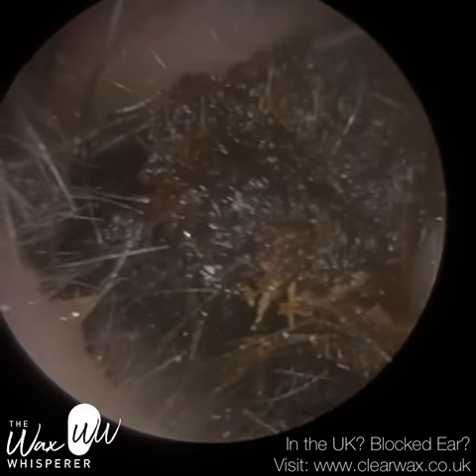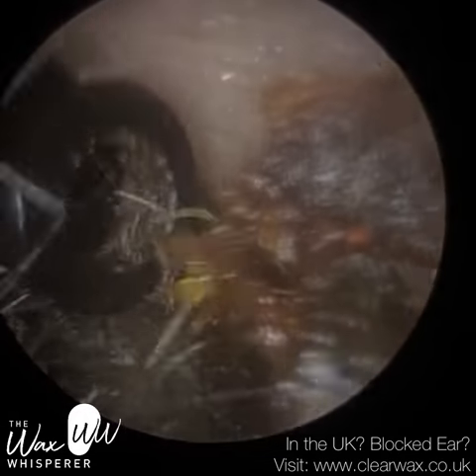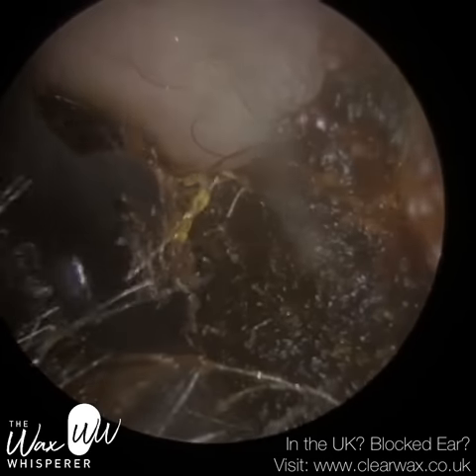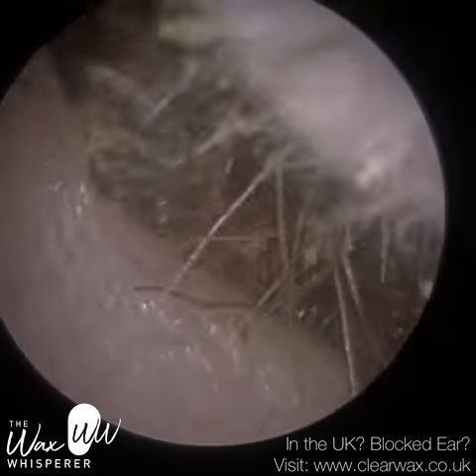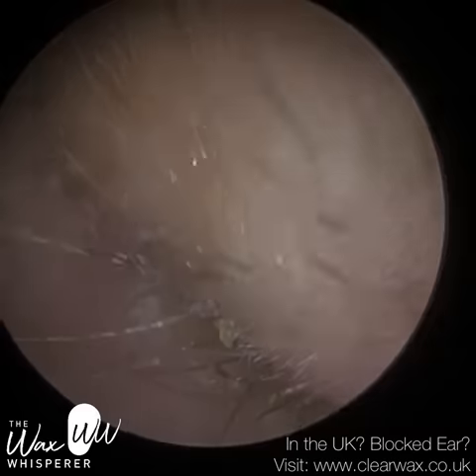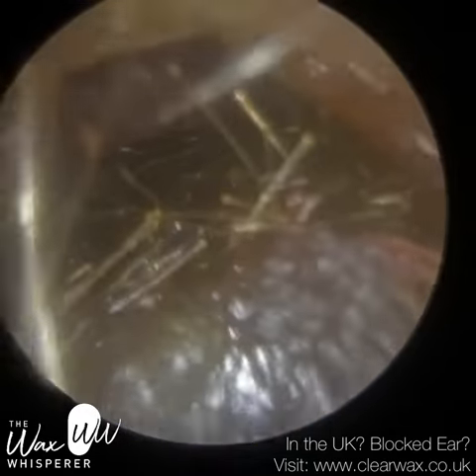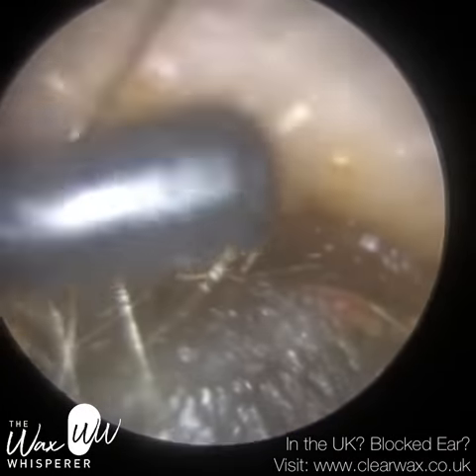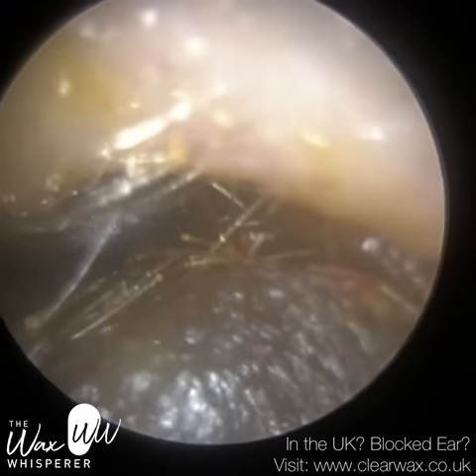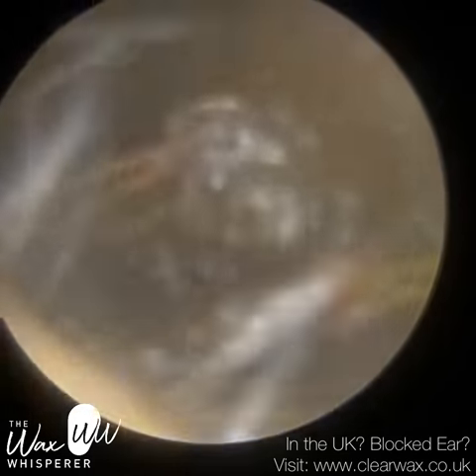So I'm just using a combination now of a Jobson horn and a St. Barks earhook. I'm just trying to leverage this out, doing it in pieces and blocks. You can see that I've actually used the Jobson horn to dissect some of the wax into a smaller piece and bring that out. There's a little gap, a little opening just at the roof side. I think I'm going to go with an earhook so I can glide over the top, in and behind, and I'm just going to go into the core of the wax.